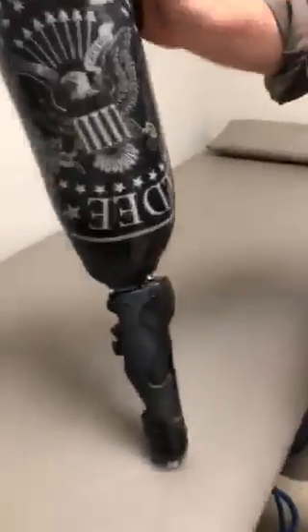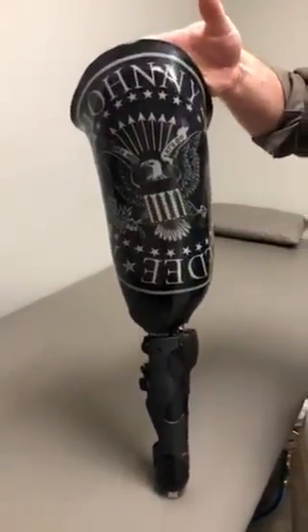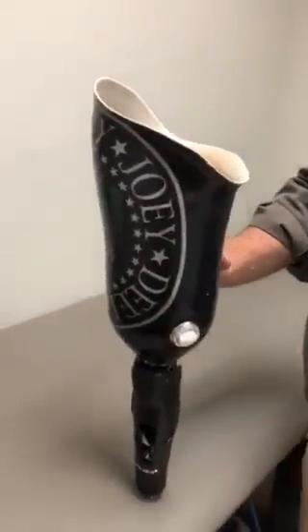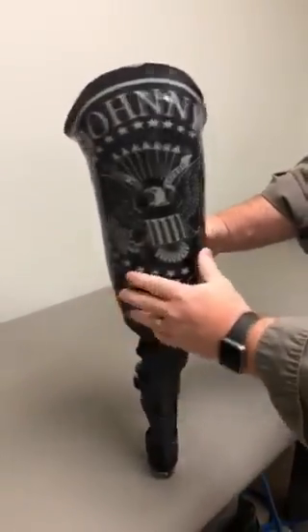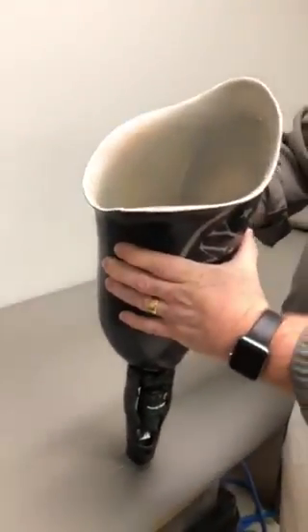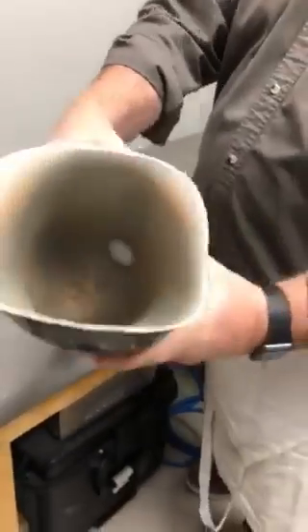They're customizable — we're bringing back the Ramones with this socket for the patient that requested it. We'll fit it this afternoon and do another video of him walking on it, so y'all get to see the patient reaction. This will be his first prosthesis, so he won't have anything to compare it to, but he will always have the comfort of a totally one-piece flexible socket.